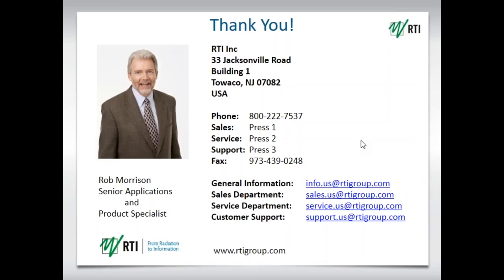The first question I do have is, does RTI Ocean Professional software come automatically with every RTI Piranha? In one sense it does. It comes with Ocean Connect, which is a subset of Ocean Professional. If you want to have Ocean Professional, you have to order up Ocean Professional as a separate item.